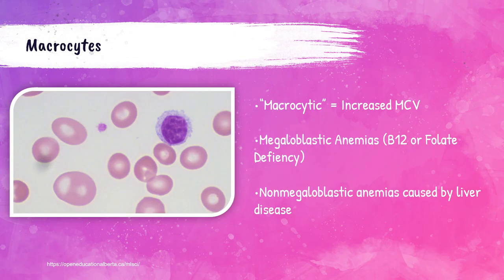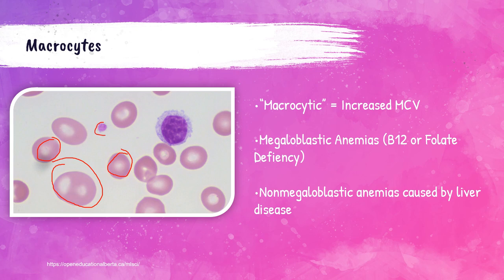Macrocytes refer to larger than normal red blood cells. This patient's peripheral blood smear has an increased MCV index. If you look at it, this is a normal red blood cell size, and look at this one — that's a huge one, that's a macrocyte. This is a platelet and this is a lymphocyte. So these are macrocytes.